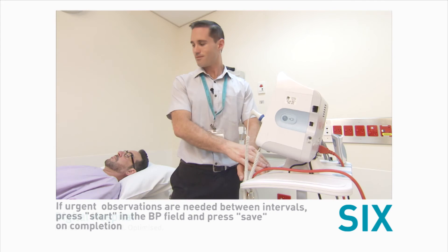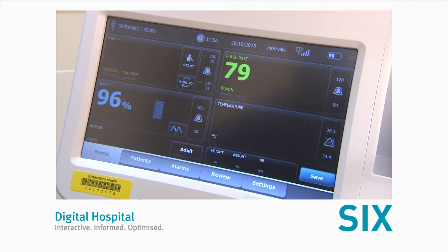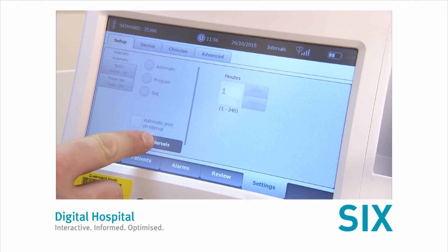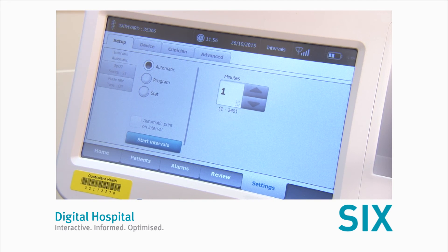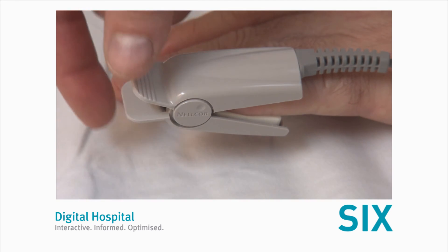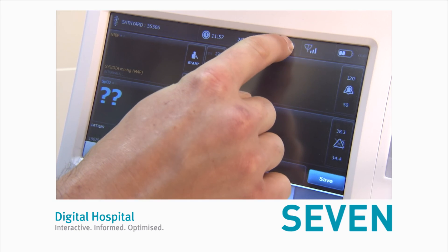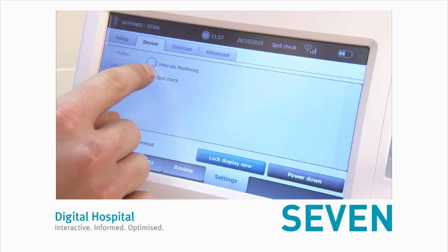Number six, once the interval observations are no longer required, touch the clock icon in the BP area. Touch stop intervals. Detach the cuff and O2 SATS probe from the patient and send any remaining results. Finally, return the monitor to spot-check mode. Touch the home tab and press save to clear any patient and clinical data.